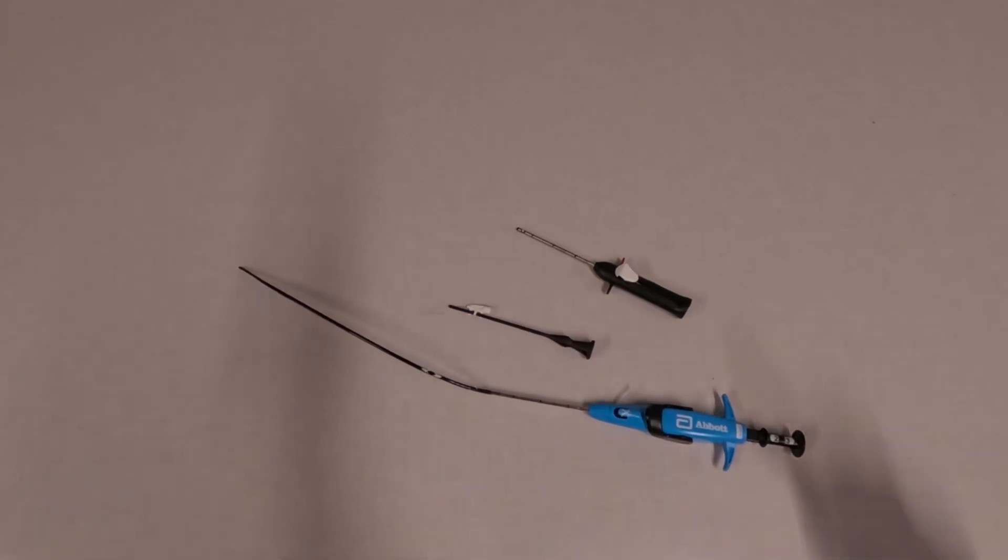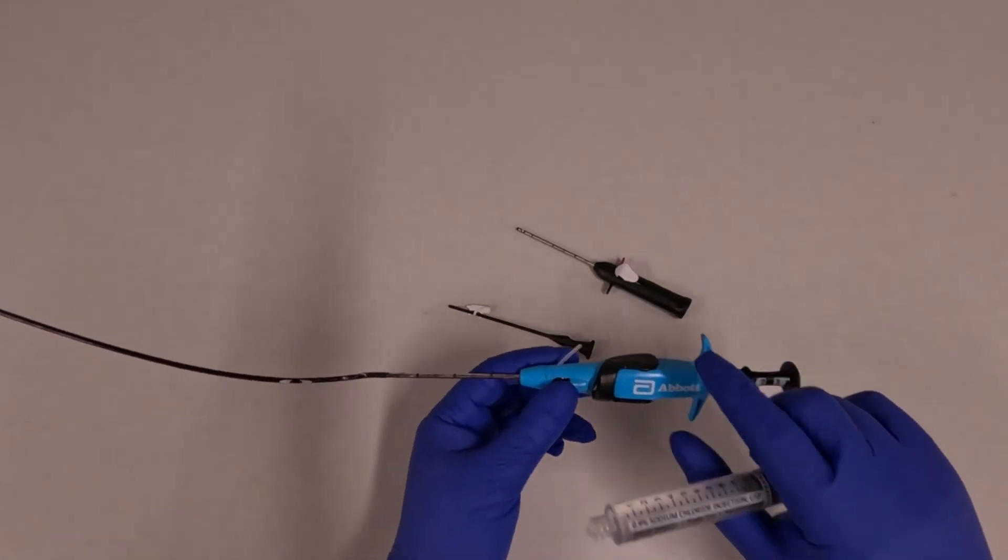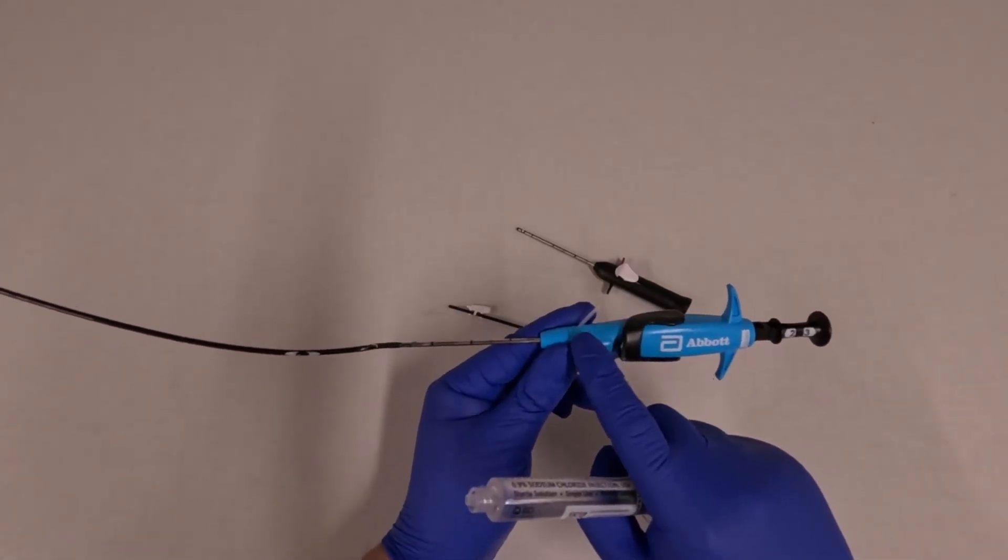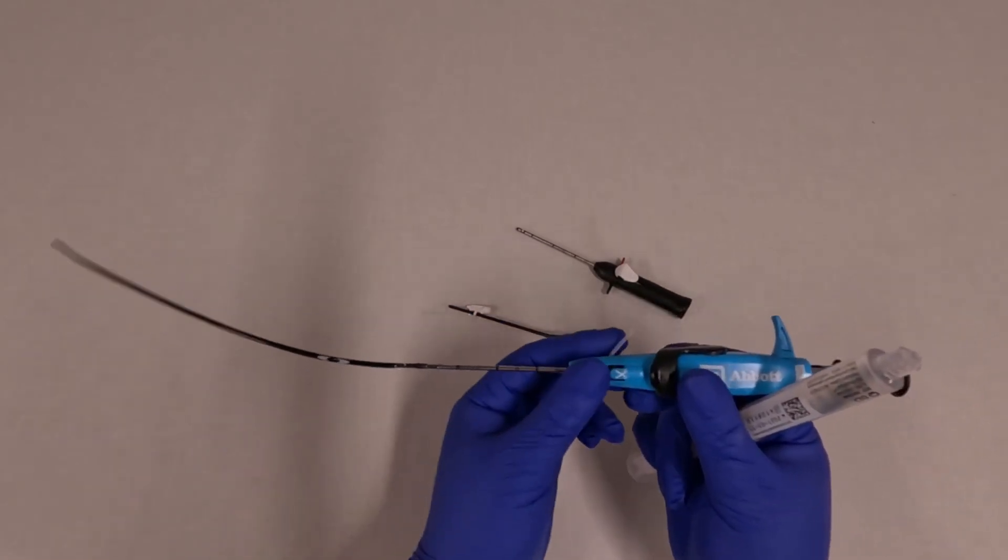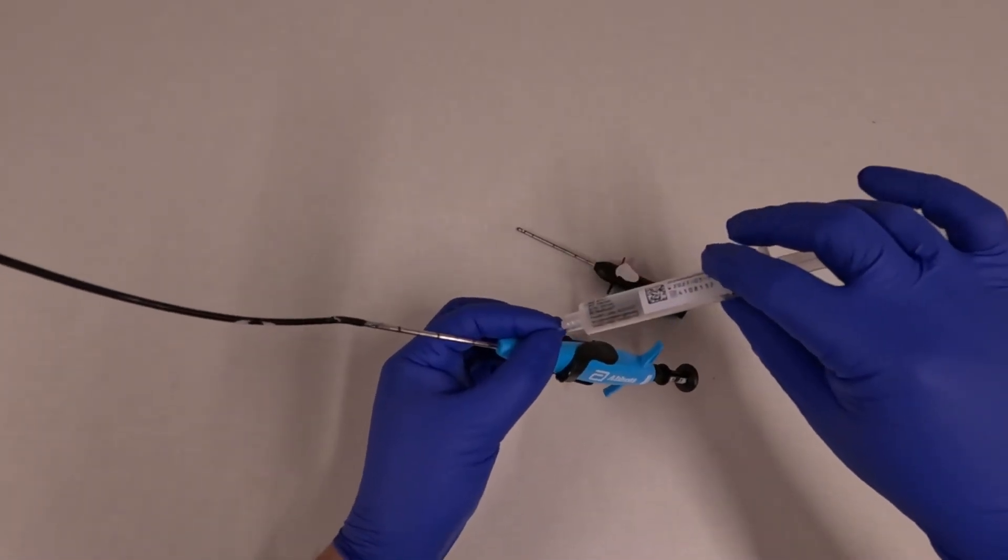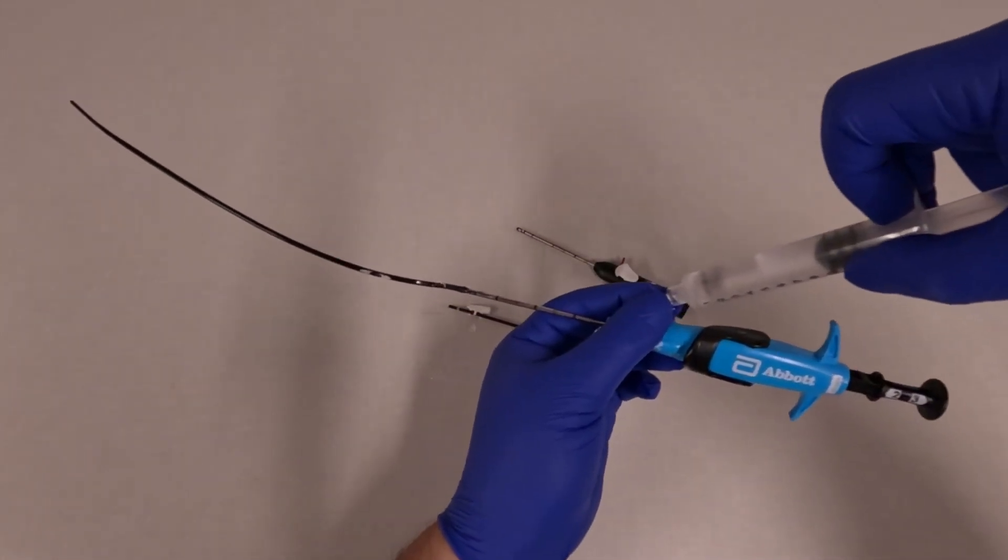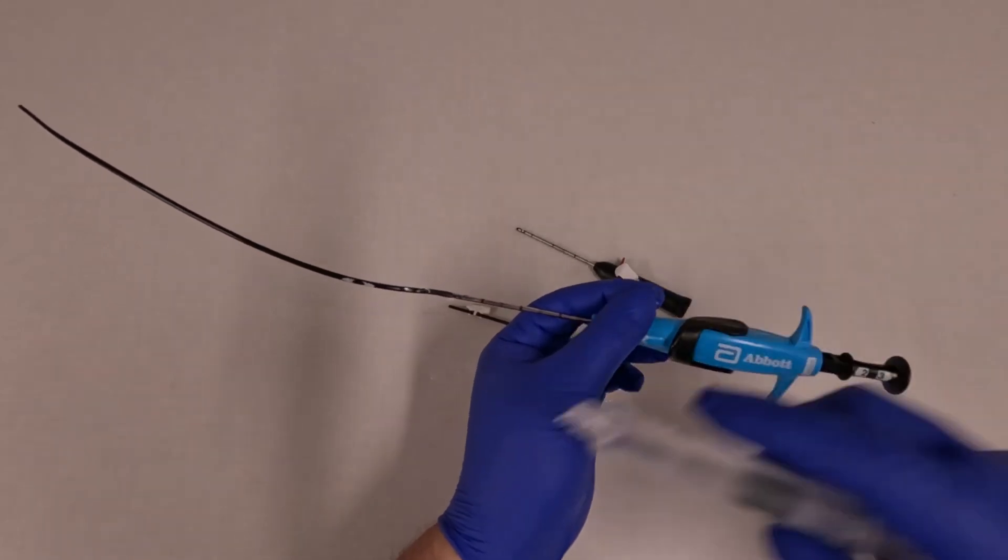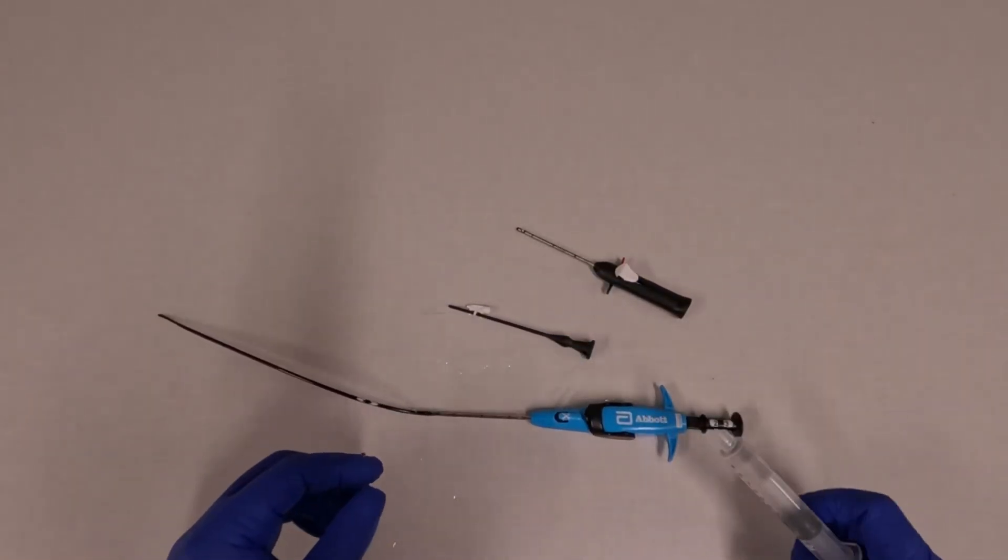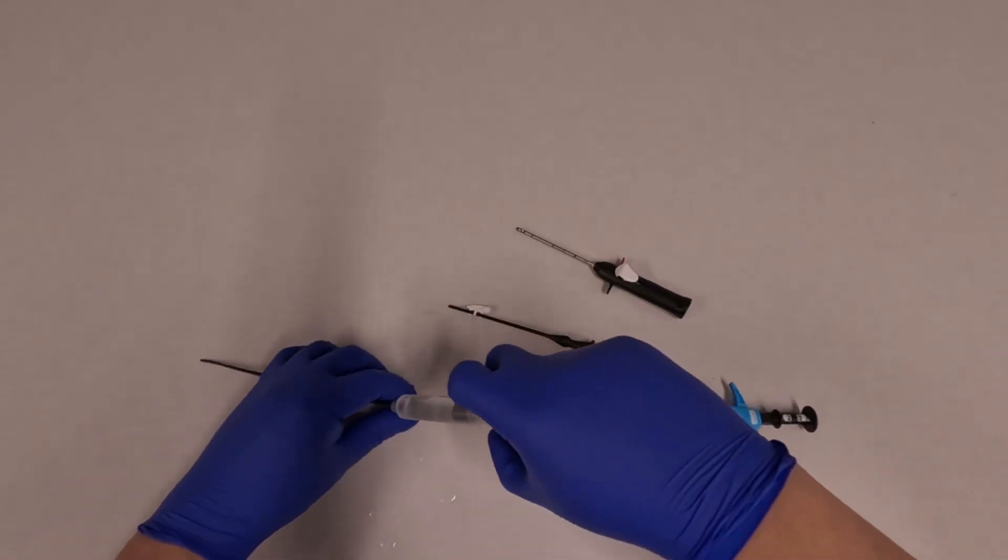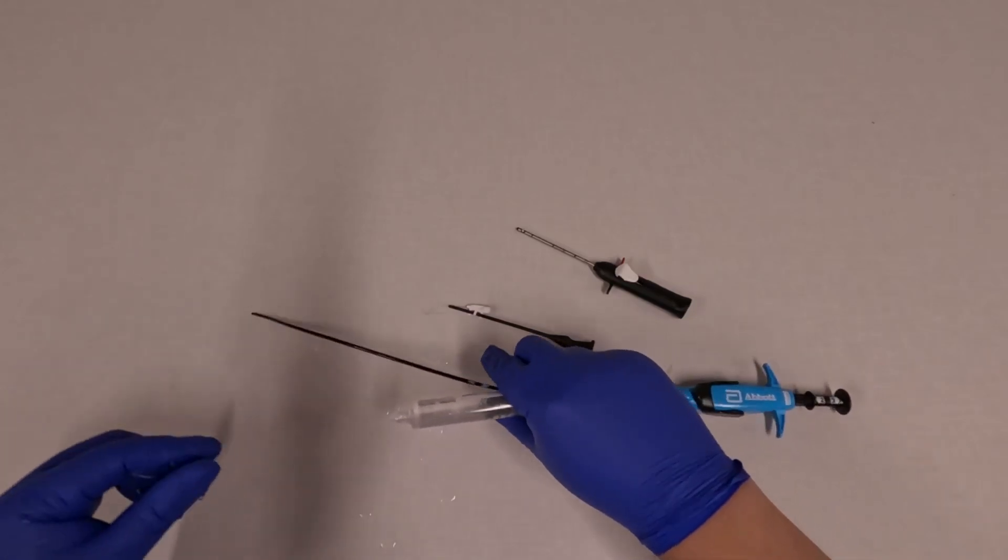To prep the device you want to get saline in a syringe and flush through the side port. This side port connects to the lumen of the device. You can see when you inject there's fluid that comes out of the hole. You also want to take a 4x4 or just wet the device itself. This activates the hydrophilic coating.